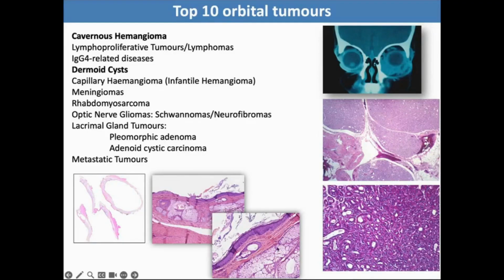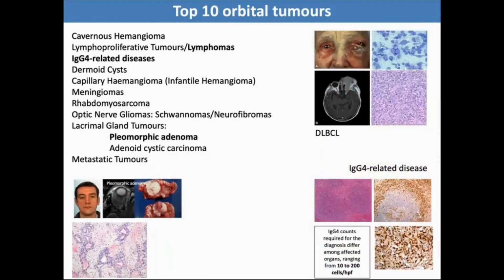The wall of the cyst can contain adnexal structures such as sebaceous units, and can also have adipose structures, or they vary in their components. More often than not, they can be excised completely, and this is required in the report, whether they have been completely removed by the surgeons.